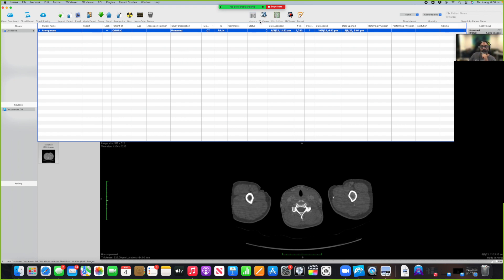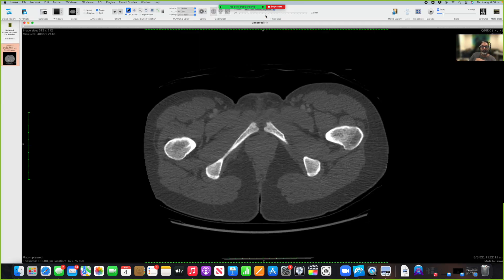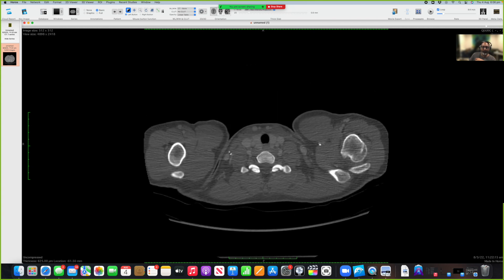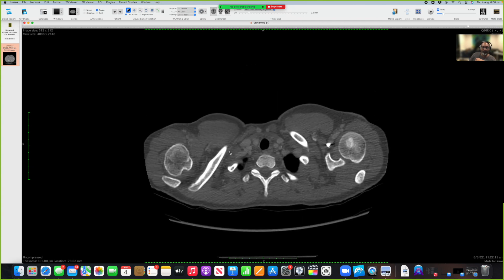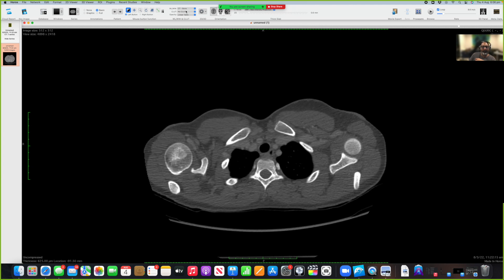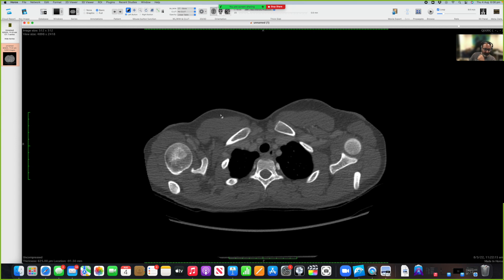Let me just start with the 2D viewer. Here we are, and we will start going through the thoracic wall. This is up at the next station. I will use the bone contrast. And here we are. Now, first let's start with the thoracic vertebrae.